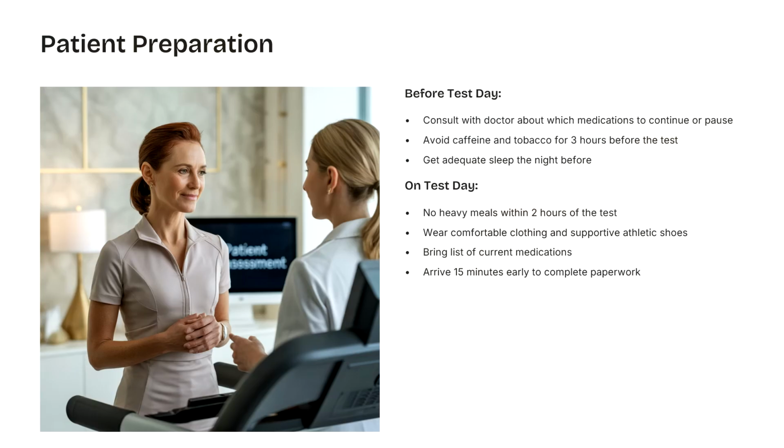Regarding patient preparation before the test day, the patient should consult with the doctor about the medications. Should they continue the medication or stop it for the TMT test? Caffeine and tobacco should be avoided 3 hours before the test, because these two are stimulating agents for the cardiovascular system. Get adequate sleep the night before. Without adequate sleep, the whole system of our body will not act accordingly. So these three things are very important.